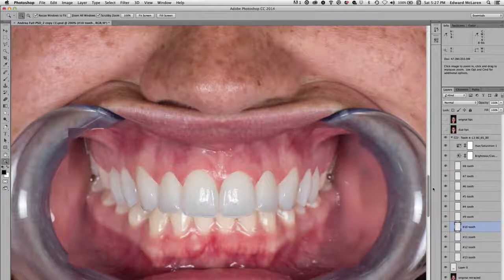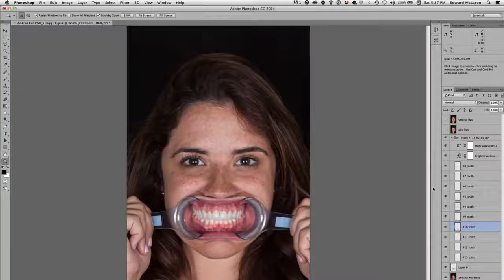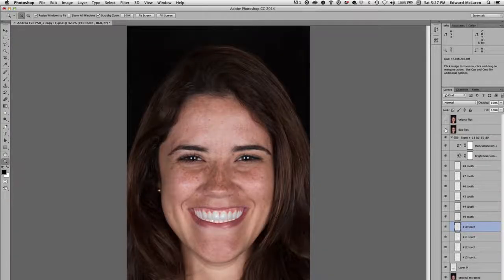Great. All right, so now let's just say we got a smile she likes. Just, Doc, that's what I like. Okay, and then of course you have to be careful what you promise, because this is just a digital representation. Now, how do we measure from here? So let's turn back on with her lips on, lips off. She likes that. Great. And I think we can do that. You show her kind of before and after. And I really would like to lengthen the centrals just a little bit myself. All right, but let's just say that's what she ends up with. She ends up with more of a look like this. But maybe if she agrees, well, how would you lengthen the centrals?